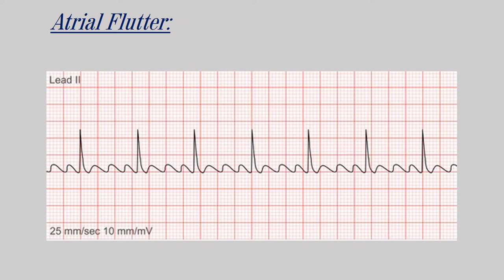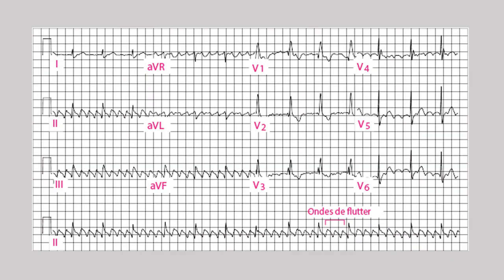Atrial flutter is when an abnormal circuit in the atrium gives the impulse instead of the SA node. It is a regular heartbeat characterized by a sawtooth appearance. We can see the sawtooth appearance clearly and cannot find a normal P wave.